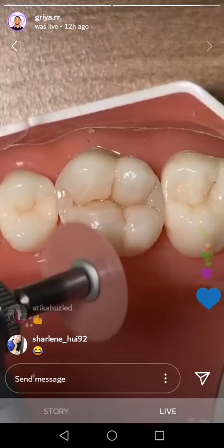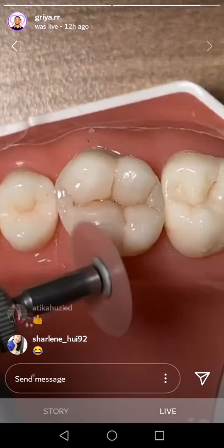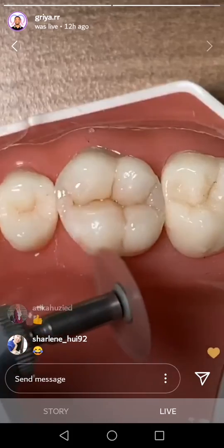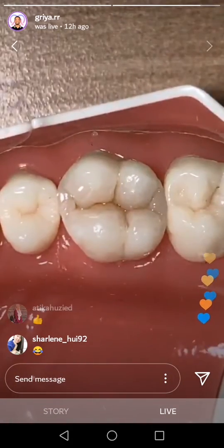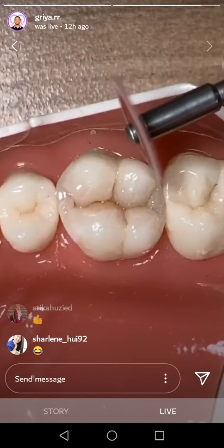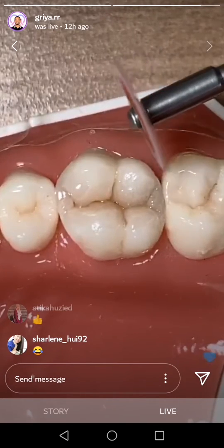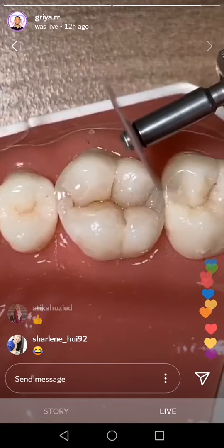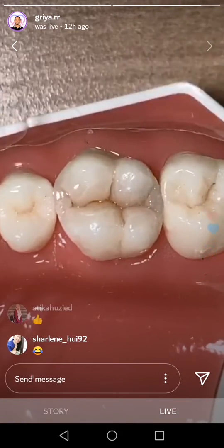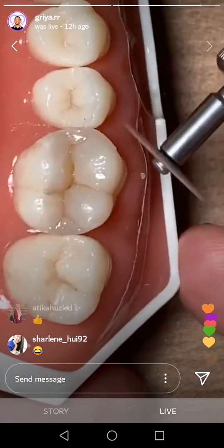See? Okay, round it again in here. Okay, and here also, last in here.